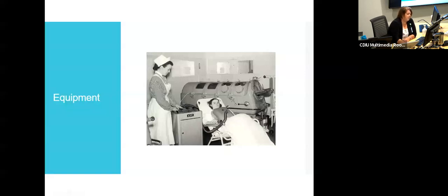It's fine. I have seen a few patients using this type of device still. They don't come very often in child size. Most of them were for adults, but they absolutely did the trick.